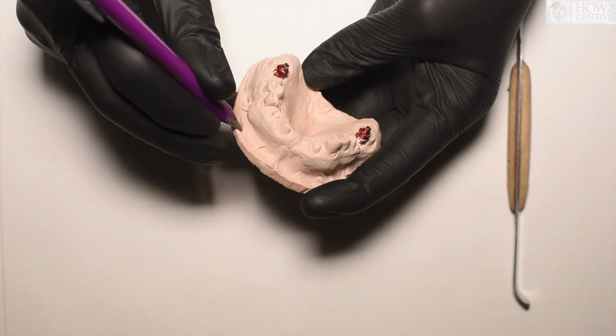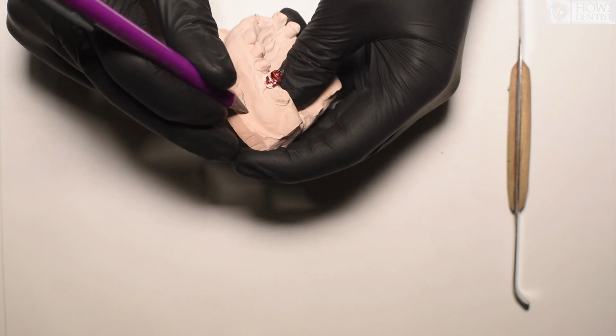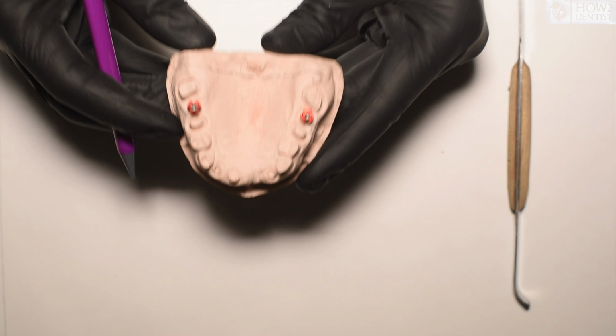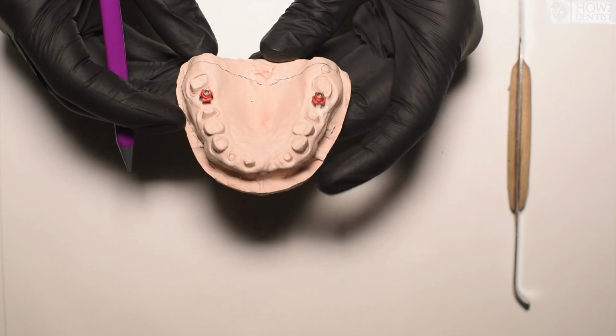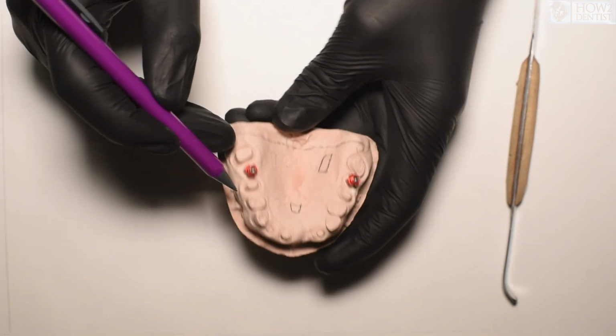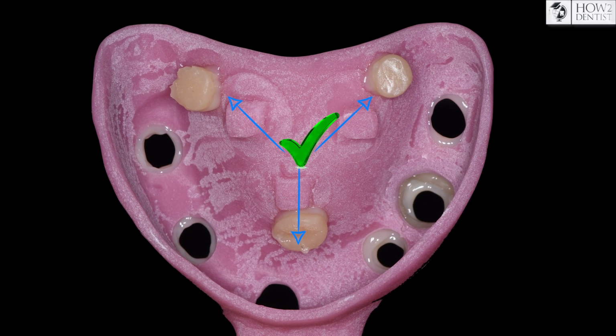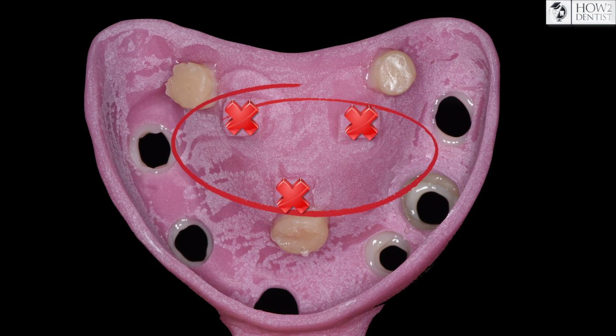Then we make the boundaries of the tray on the model, and there should also be stoppers, which in our opinion should be placed on the mucous membrane. The 3 points of support on the upper jaw are on the hard palate, 1 stop frontally, 2 others distally. In this case, they should be widely spaced, and not all concentrated in one place at the top of the palate.